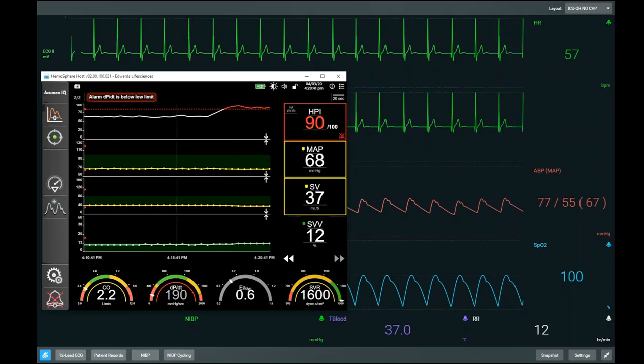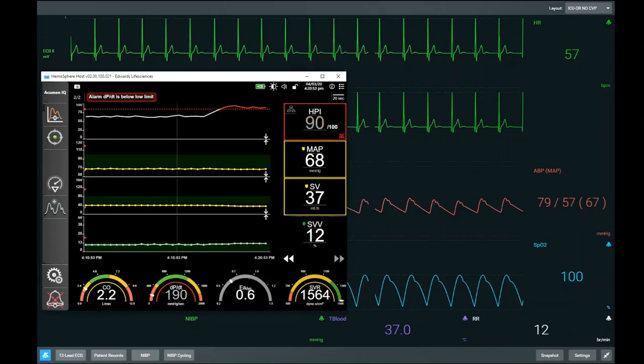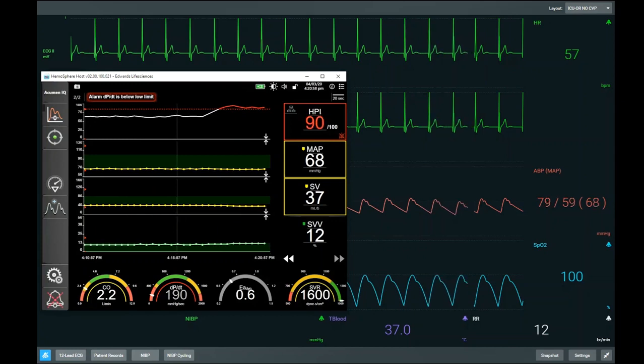Now, to think that something measured at a peripheral arterial waveform represents what's going on at the ventricle is quite a large assumption to make. We have to assume that our left ventricular end systolic elastance is equal to our left ventricular pressure time change, which is equal to this pressure time change in a peripheral artery.